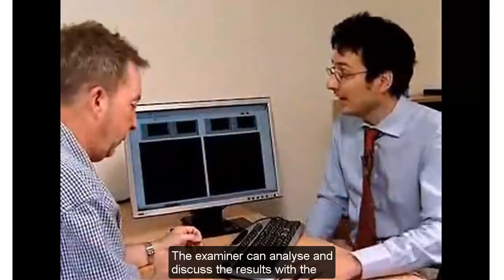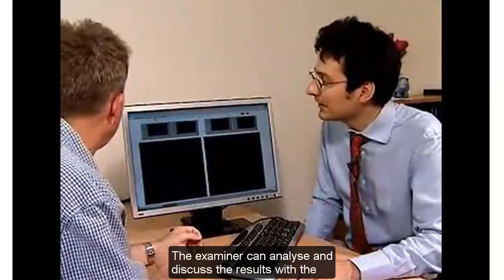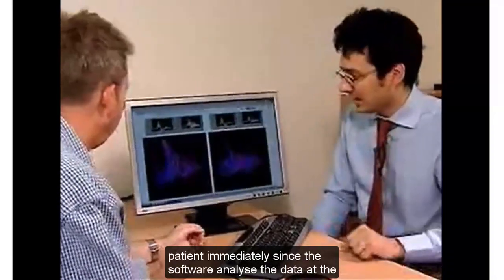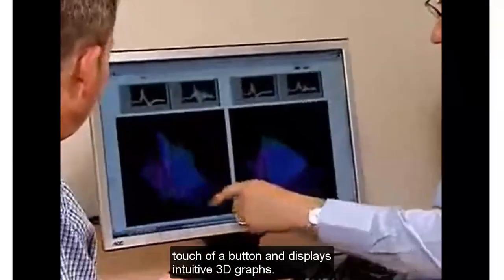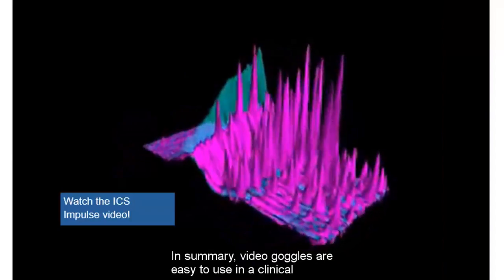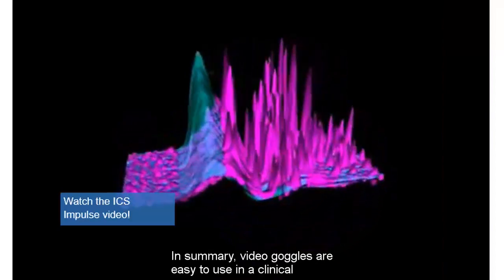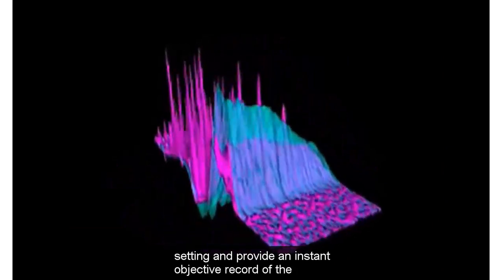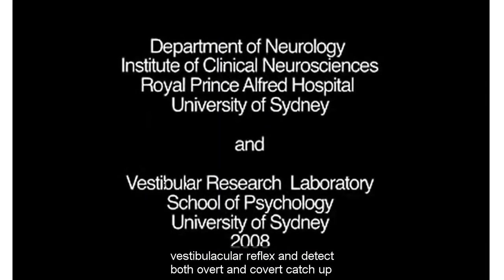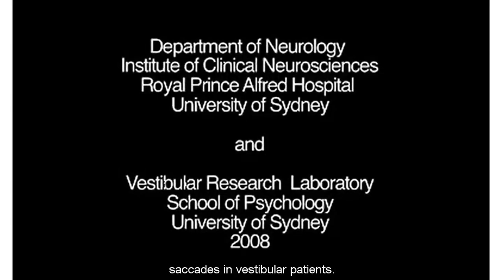The examiner can analyze and discuss the results with the patient immediately, since the software analyzes the data at the touch of a button and displays intuitive 3D graphs. In summary, video goggles are easy to use in a clinical setting and provide an instant objective record of the vestibulo-ocular reflex and detect both overt and covert catch-up saccades in vestibular patients.